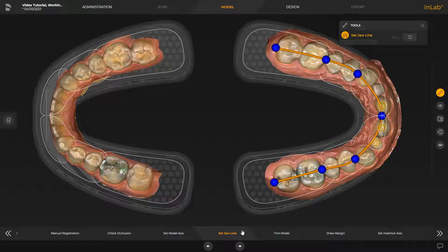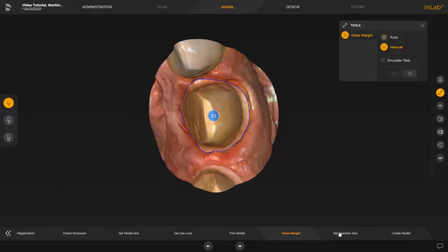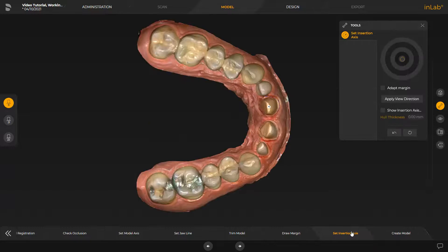We have adjusted the Jawline accordingly and switched to the next step, Draw Margin, since the Trim Model step is automatically performed by the software. In this step, we have already manually determined the preparation margins of the three restorations. Therefore, they will automatically be transmitted to the InLab Model App later on. We proceed with the Set Insertion Axis step. The insertion axis is automatically suggested by the software as well. If needed, the axis can be adjusted for all three restorations by moving the arrow on top of each preparation.